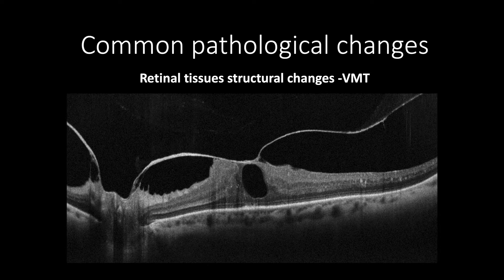This cross-section of VMT shows perifoveal posterior cortical vitreous detachment with central adhesion of the posterior cortical vitreous causing anterior-posterior oblique traction, inducing increased retinal thickness and cystic formation along with disruption of the ellipsoid zone.